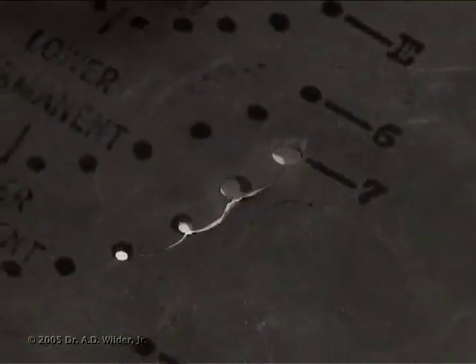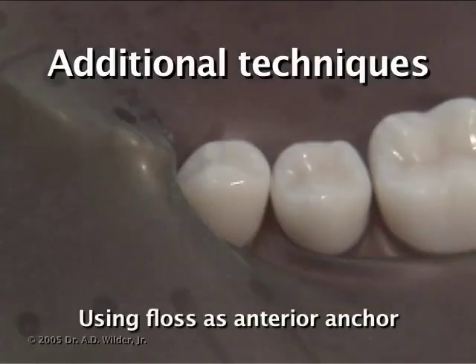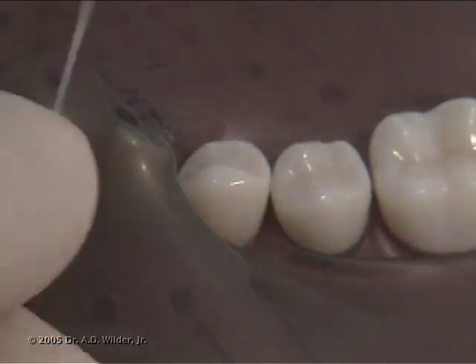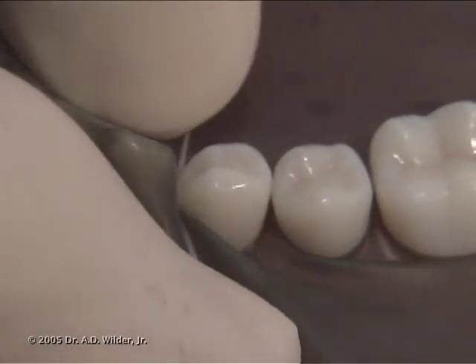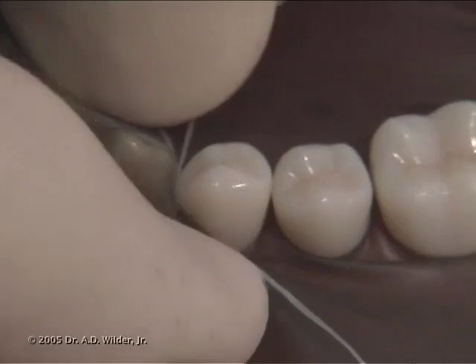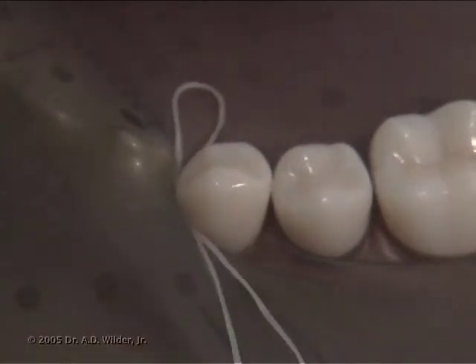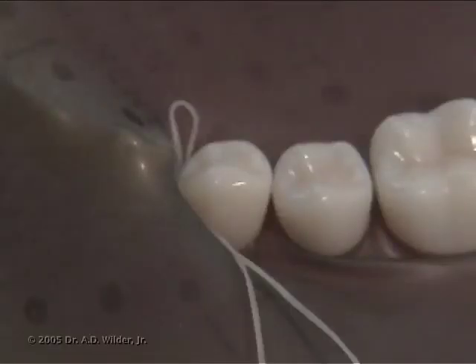You can check to make sure no rubber was left behind between the contact areas of the teeth. You can use floss as an anchor in some cases — place the floss through a tight contact once and then again, pull through until you have a small loop on one side of the contact area, and then trim away the excess from the free ends.